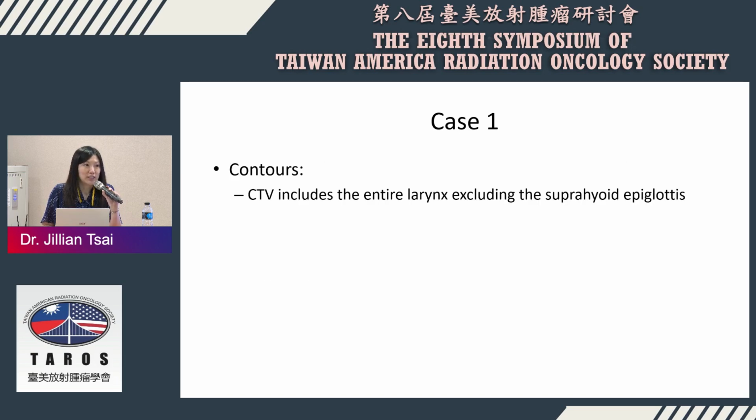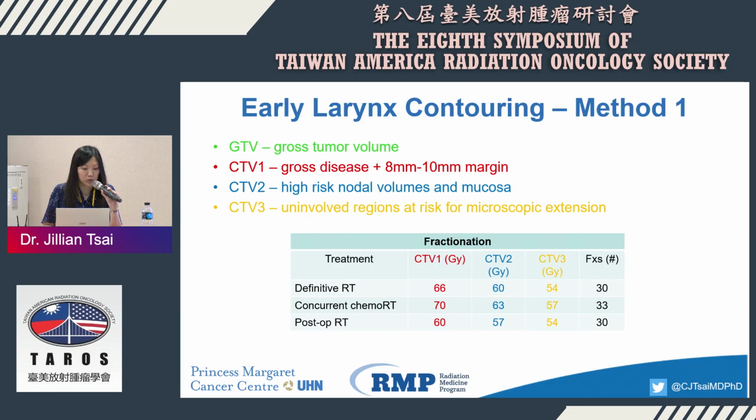Traditionally, before IMRT, we would do a 5x5 field, right? The field for T2 is probably 6 centimeters, with extension up and down. With the invention of IMRT, we started contouring out the carotid arteries to try to avoid the doses. And this is one of the most commonly used approaches here. This is one of the regimens at MD Anderson.